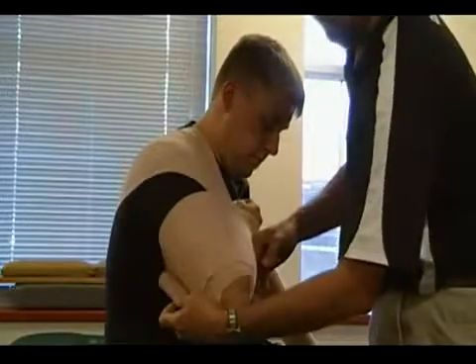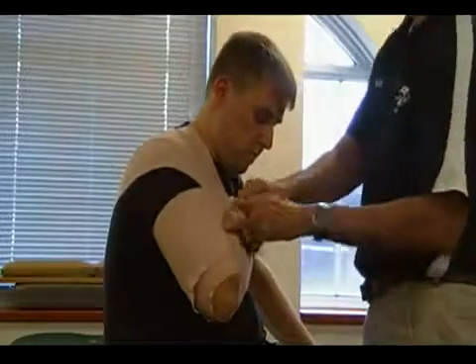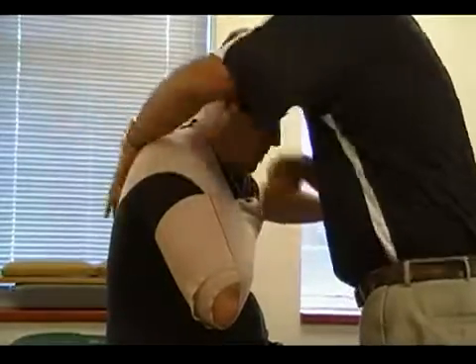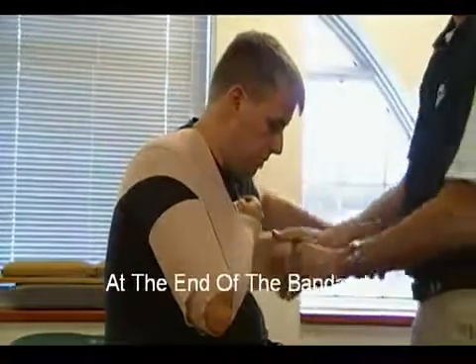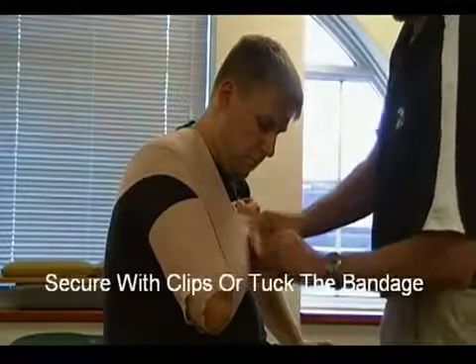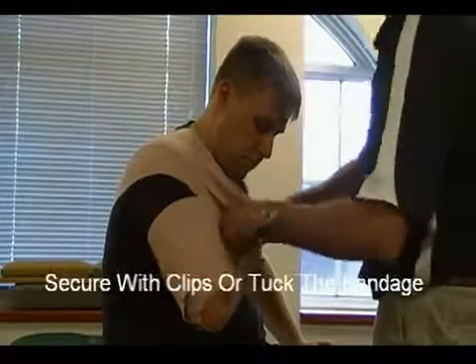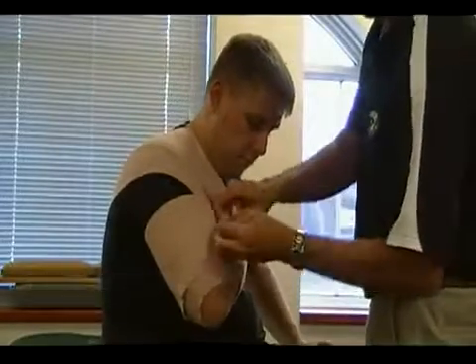At this point, I can either come around again supporting the elbow, and then wherever it ends, I can secure it with my clips if necessary, or in the case of an emergency, I can pull it and tuck it in underneath.